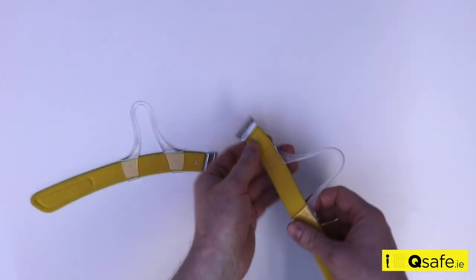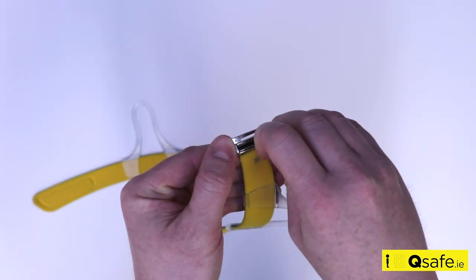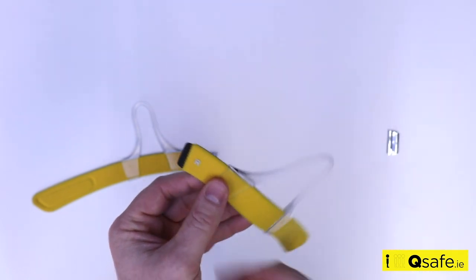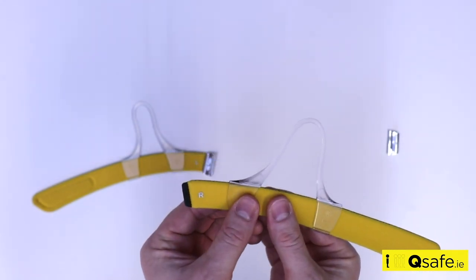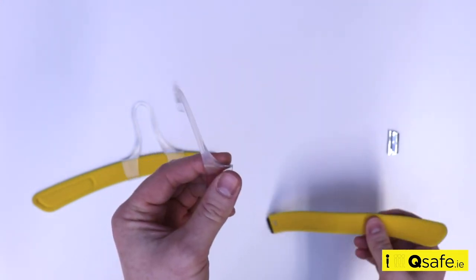To disassemble the headband for cleaning, firstly unlock the silver clasp as shown. Then detach the clasp. Simply remove by sliding them off the headband in the direction of the narrow end.